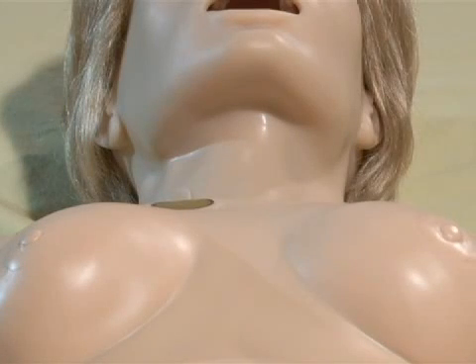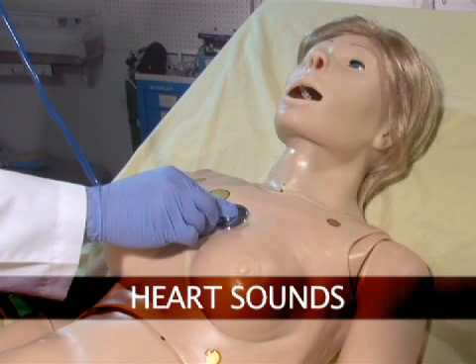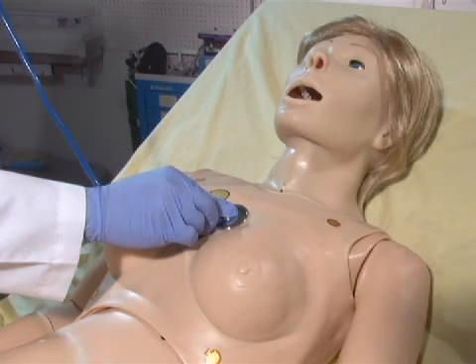Either lung can be disabled at any time to simulate a collapsed lung. Suzy is equipped with several realistic heart sounds, which are tied to a user-defined heart rate and selectable rhythms.